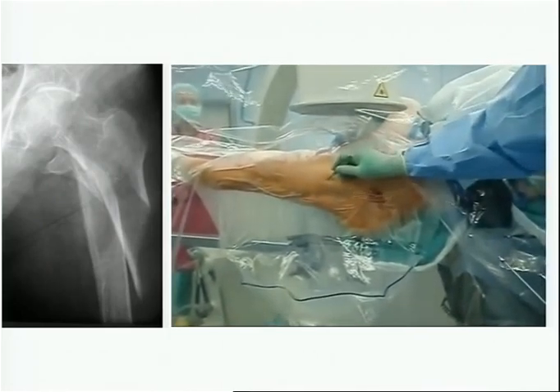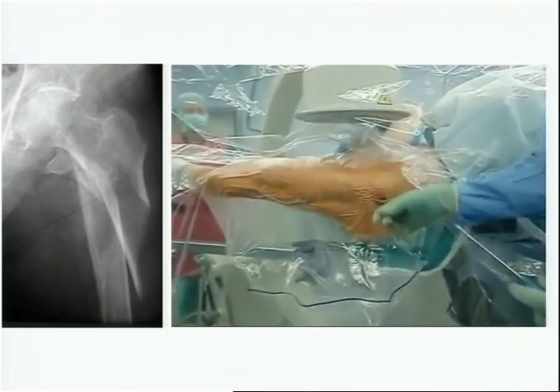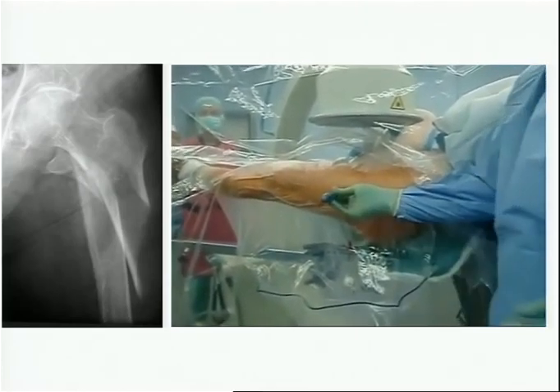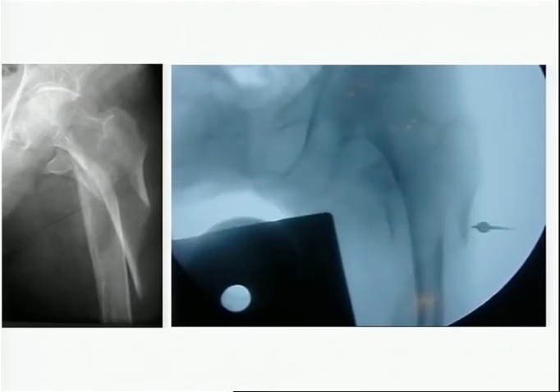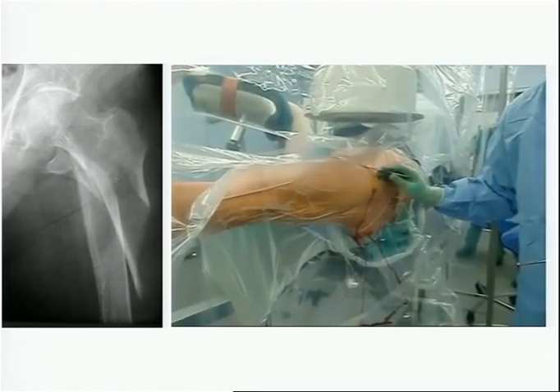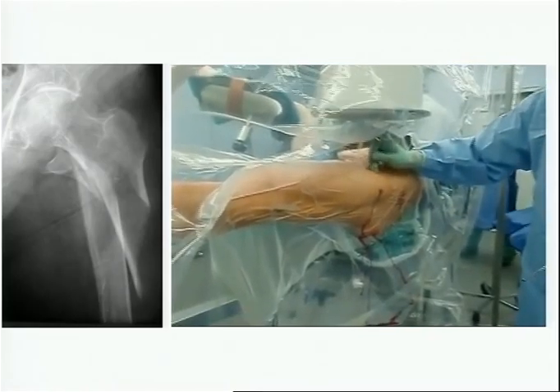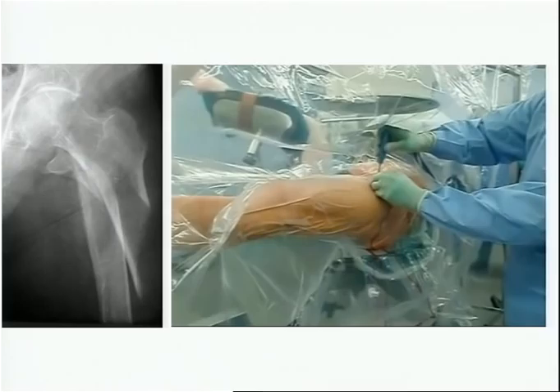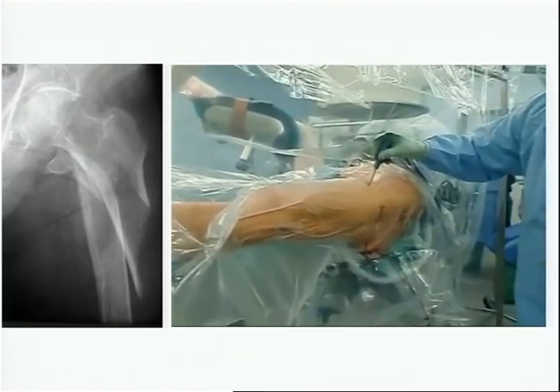Here is a sub-trochanteric reverse oblique shaft fracture. To get varus control, you can make a stab incision and with a ball spike reduce the fracture, then find your entry point and insert the nail. Similarly, if there is flexion of the proximal fragment, you can use an anterior stab incision, push down the ball spike, and get control of the proximal fragment — the fascia was a bit tight — and now it's reduced and you can insert your nail.